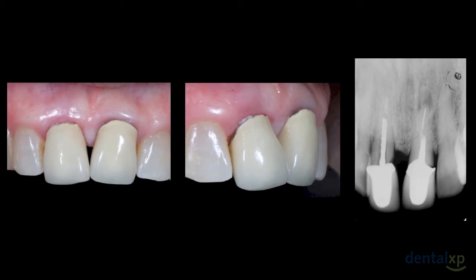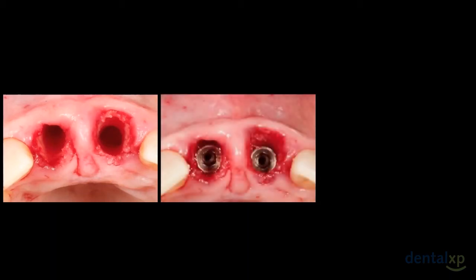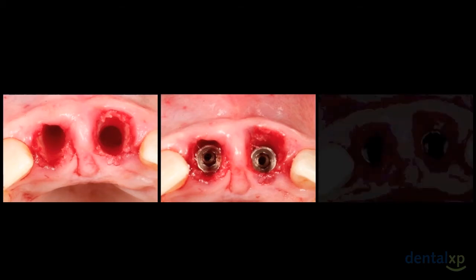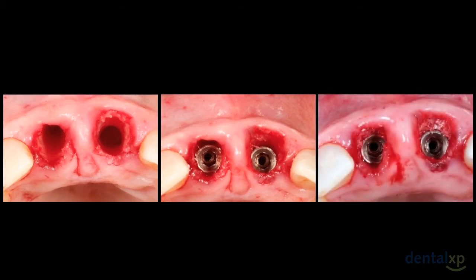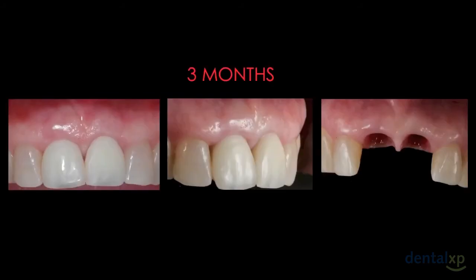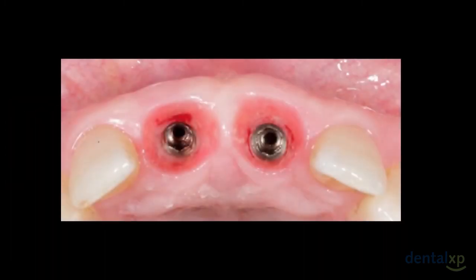In this case, there was a root fracture on the left central incisor and the right central incisor was periodontally compromised. After tooth extraction, two platform-switching implants were inserted — both alveolar sockets presented a total absence of the buccal bone wall. After reconstruction, the clinical aspect at three months, when the provisional crowns were removed, shows a good volume of soft tissues, with special attention to the volume of the papilla between the implants.